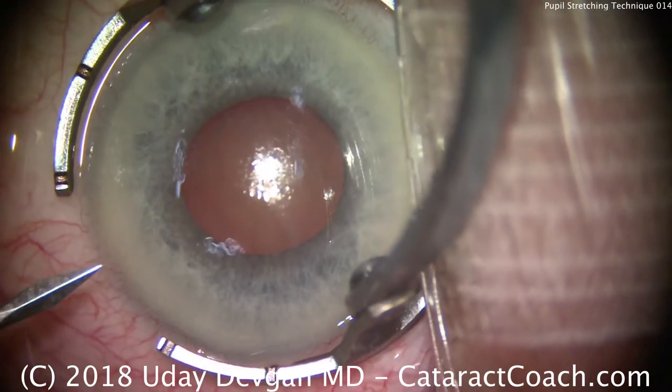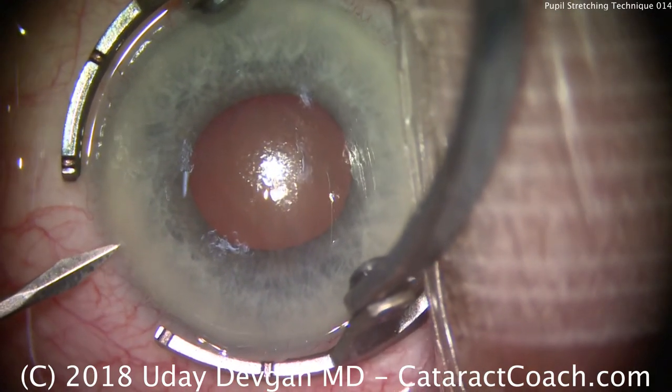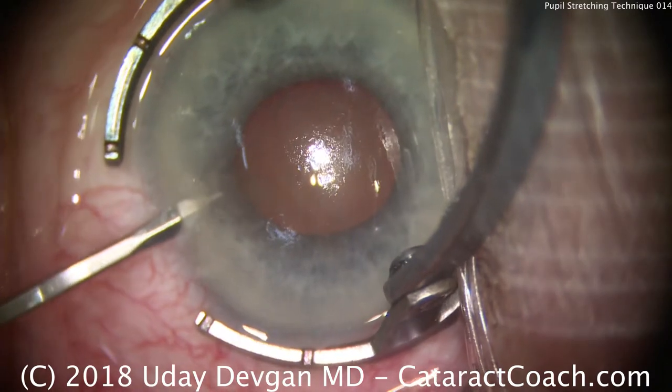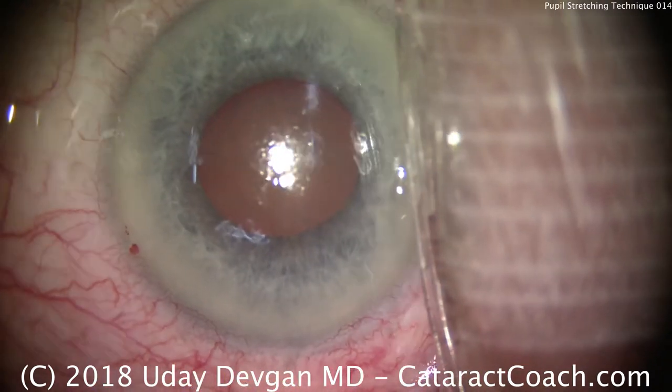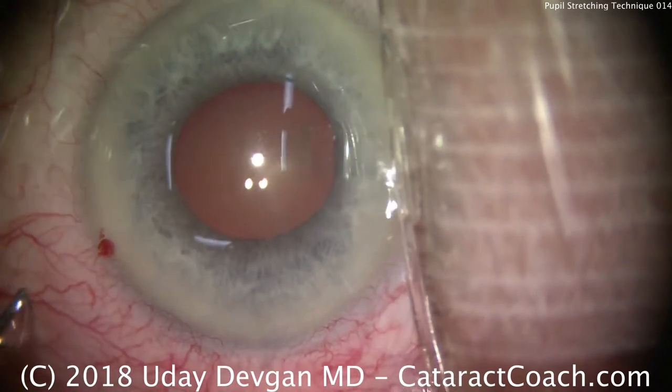Let's talk to you again, your cataract coach, with a small pupil cataract case. Not the tiniest of pupils, but a case where the pupil is only about 4 millimeters. The patient also has floppy iris syndrome from Flomax use.